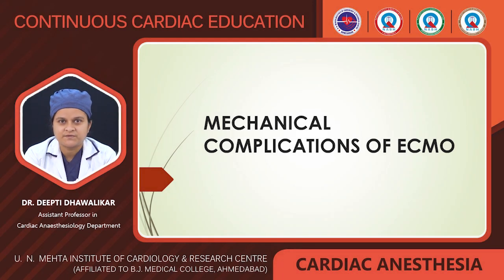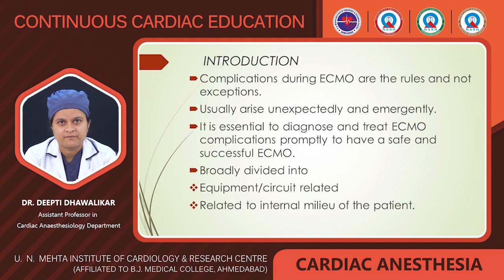We are continuing with the ECMO series, and today's topic is on mechanical complications of ECMO. So complications during ECMO are the rule and not an exception. Usually they arise unexpectedly and emergently. It is essential to diagnose and treat the ECMO complications promptly to have a safe and successful ECMO.